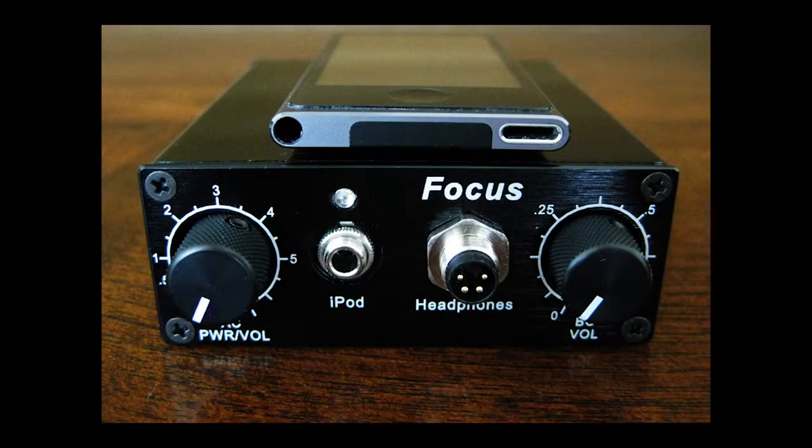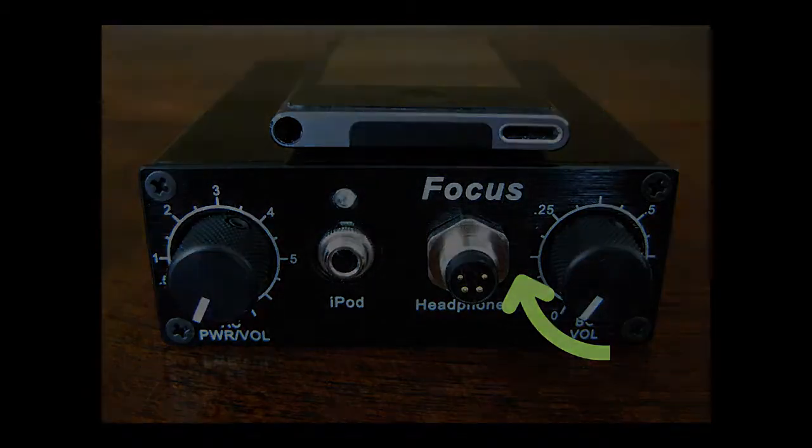Let's take a look at the amplifier. Looking at the front panel, on the left is the air conduction or AC volume knob, which is also the on-off control. When you turn the knob, the blue light will come on. The air conduction volume controls the sound coming through the headphone ear cups. On the right is the bone conduction or BC volume knob, which controls the volume of the bone conductor built into the top of the headphones.